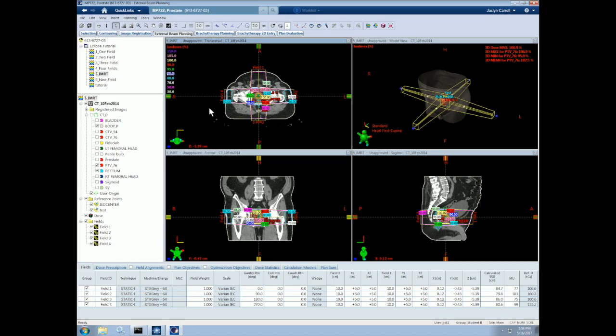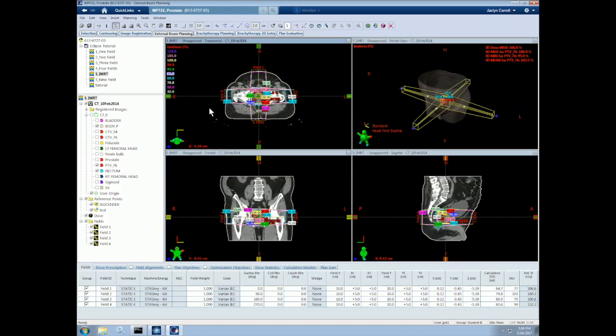The difference between 3D and IMRT is that in a 3D plan, our MLCs are static throughout the duration of each beam, but in IMRT however, each beam includes a series of MLC positions which modulate the beam's fluence throughout the duration of its delivery. This enables more conformal dose distributions so we can increase the dose to the target while minimizing the dose to the critical structures. The fluence is optimized using a cost function that I'll discuss later in this video.